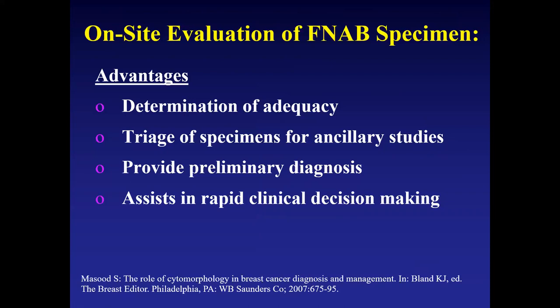Let me spend some time and talk about on-site evaluation of fine needle aspiration biopsy and what the advantages are. Advantages include determination of adequacy, triage of a specimen for ancillary studies, providing a preliminary diagnosis, and assisting in rapid clinical decision-making.